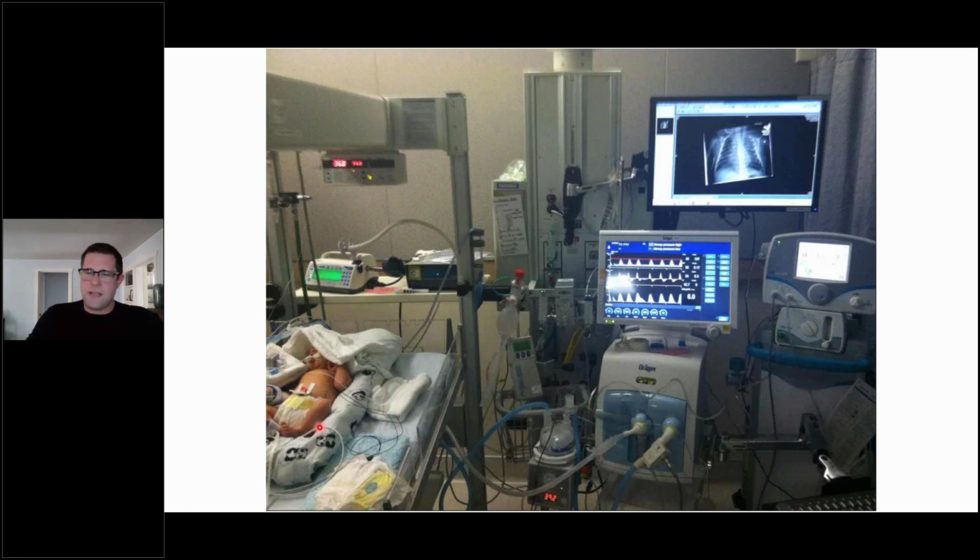In any situation where you have a mechanical ventilator that incorporates a proximal flow sensor, I would say it is very important to actually integrate that, use that, make it work. I know sometimes it can be a pain, but if you want to become an expert at airway graphics, you in fact have to be able to measure those flows and those volumes right there at the patient. Pressure is always measured within the ventilator back here.